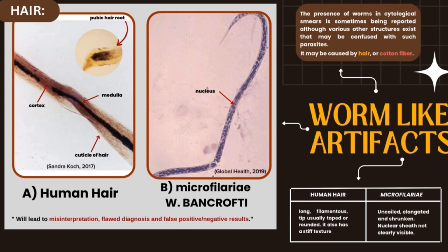As you can see on this slide, there are slight differences between these two. In human hair, we can see the medulla, cortex, and cuticle of the hair, while for the microfilariae, we can see a lot of nuclei in the body of the parasite. On the other hand, what makes them look similar is that both have a long, uncoiled body. This can lead to misinterpretation, flawed diagnosis, and false positive or negative results.